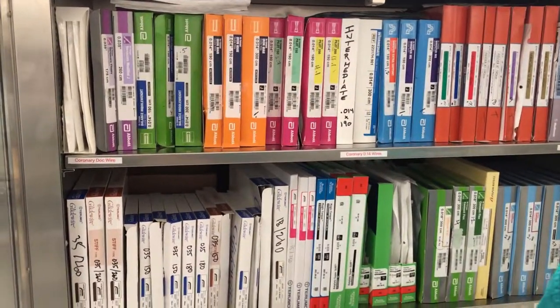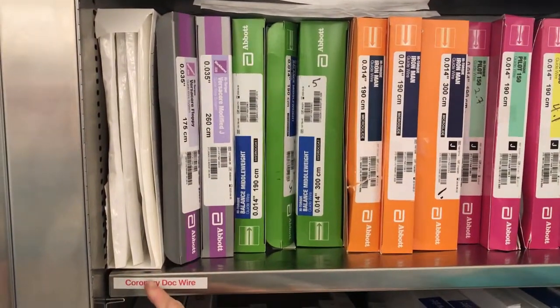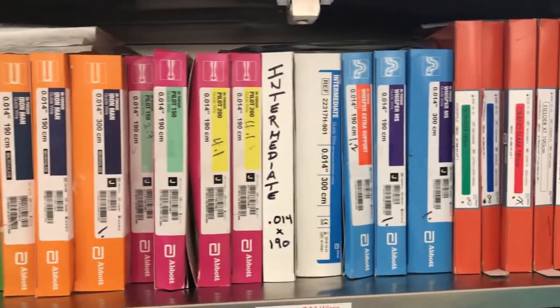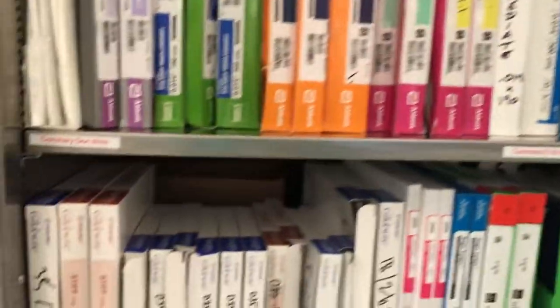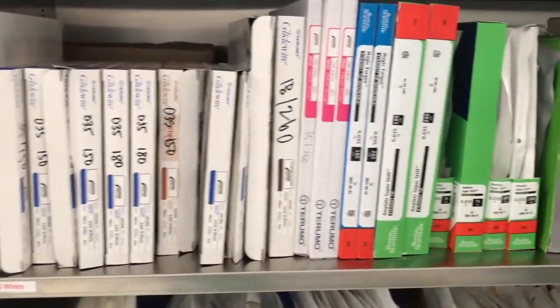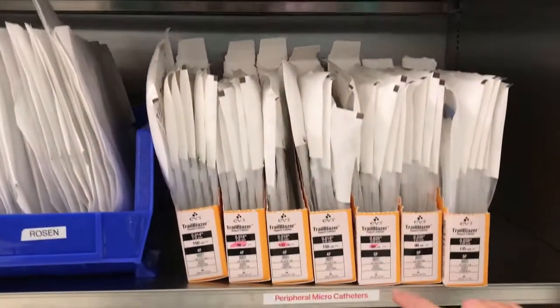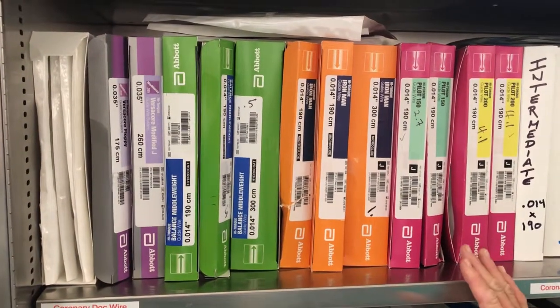Here's how we organize the shelves. The top row is all your coronary items, starting from your coronary dock wire — used when you want to extend a short wire to a long one. These are all your 0.014 coronary wires, and these are your coronary microcatheters and specialty guideliner. The next row down is all your peripheral wires, starting with 0.035, then moving over to all your 0.018 peripheral wires, to all of your 0.014 peripheral wires. Microcatheters for the peripheral are one shelf below.